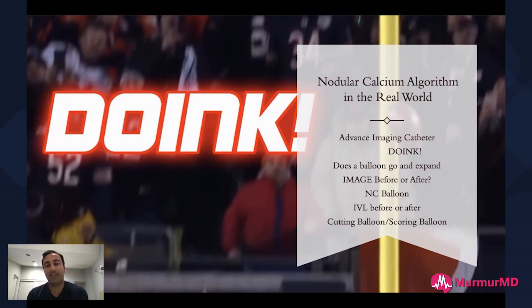So my question for the folks watching is, what's your algorithm? Do you just go up from a compliant balloon to a non-compliant balloon and see if the non-compliant balloon expands? Are you putting stents in? Are you more likely to use a lithotripsy balloon, or do you use a cutting or scoring balloon, or do you just go with atherectomy, particularly in the cases where you can't really deliver anything?